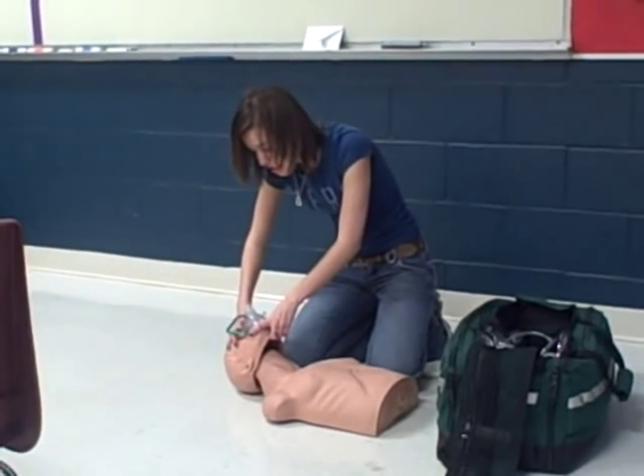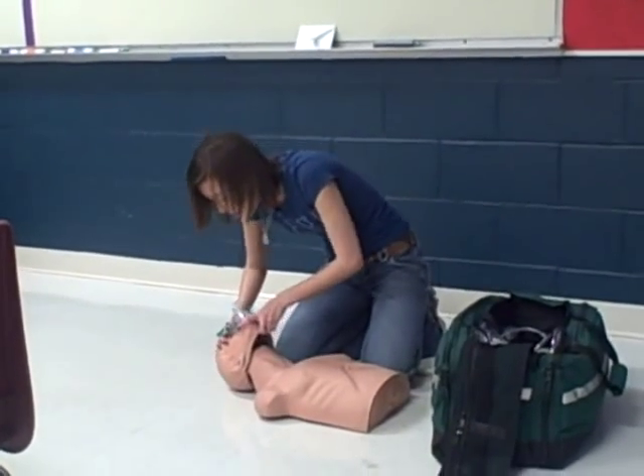2-1000, 3-1000, 4-1000, 5-1000. That's your time.